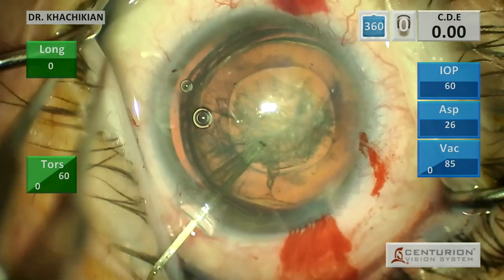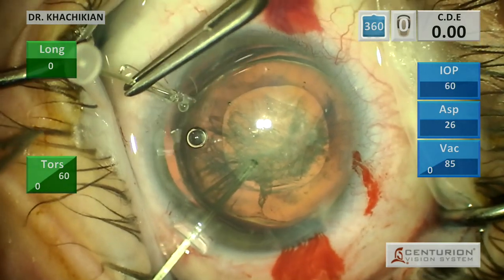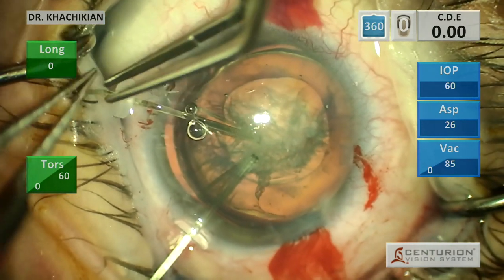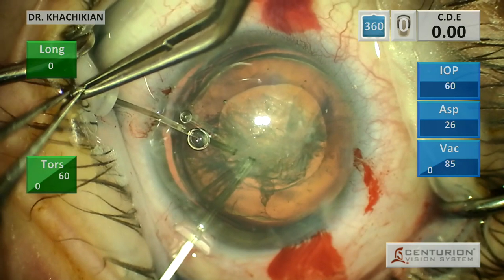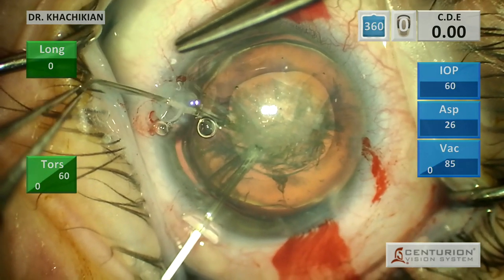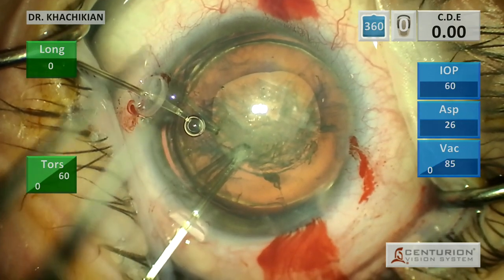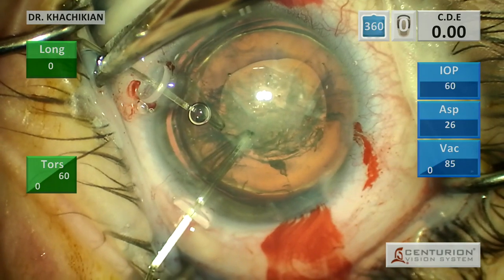We're going to place two hooks - we've got one superior and one more inferior in the view, with our side port incision in between the two. We'll get it all the way in for a good purchase. You can see the distal end of that hook gets all the way into the capsular fornix, and it pulls minimal cortex with it, which means our viscoelastic probably got into a relatively good position to allow the hook to be right up against the capsule. You might want a buffer of cortex there, but the problem is it makes it harder to get the cortex out if you need to leave the hooks in when you remove the cortex.